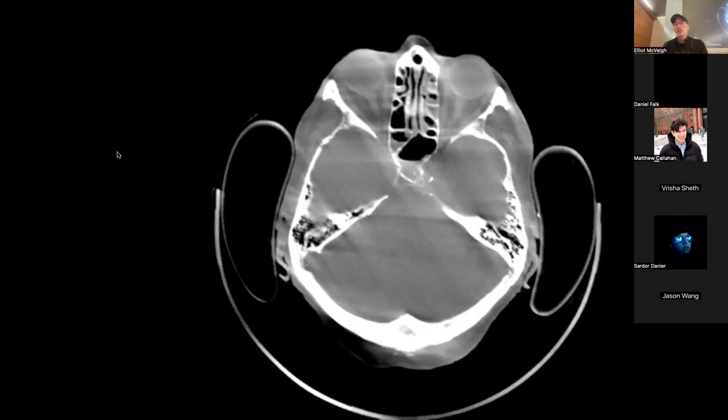So this is actually using the back projection. It's called convolution back projection, and we're going to figure out how to do this, right? This is obviously not that back projection we just looked at where we have fuzzy stuff in the background and stuff. We're going to learn how to do this convolution back projection.